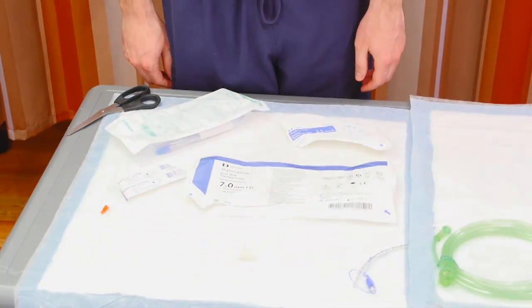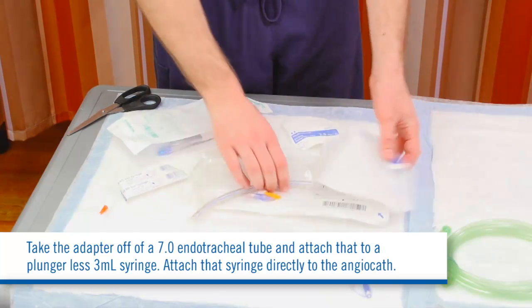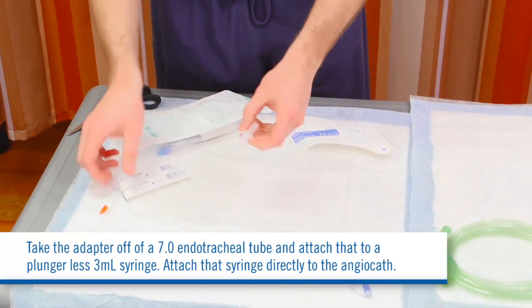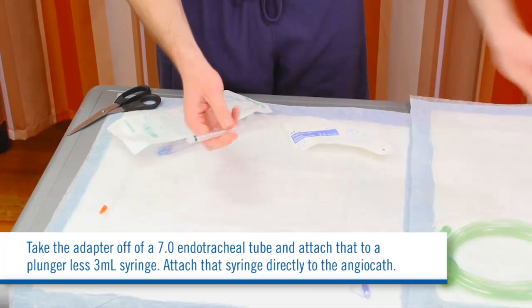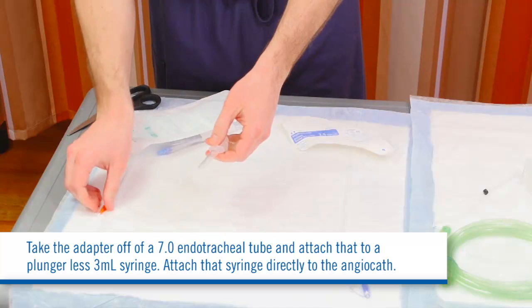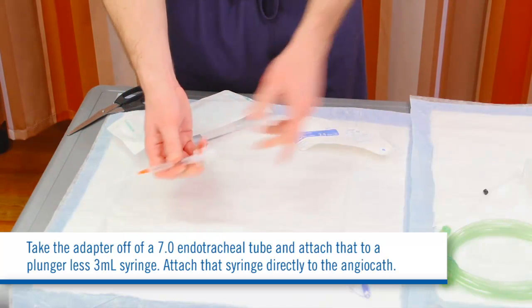Number 2, take the adapter off of a 7.0 endotracheal tube and attach that to a plungerless 3 mL syringe. Attach that syringe directly to the angiocath.